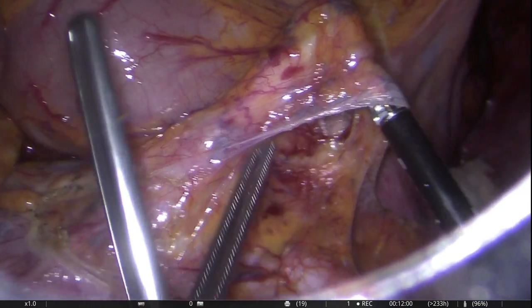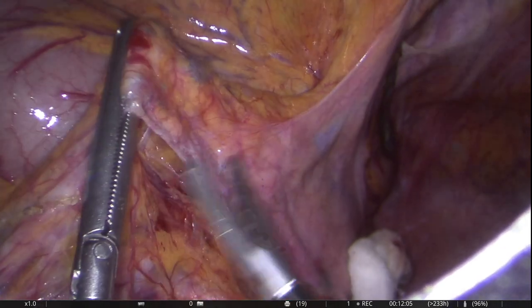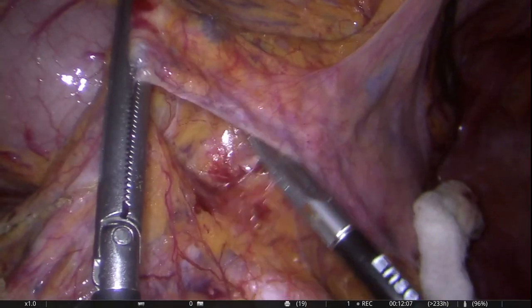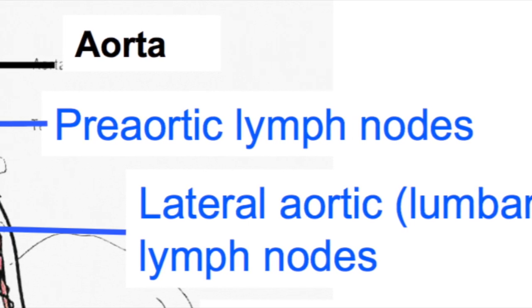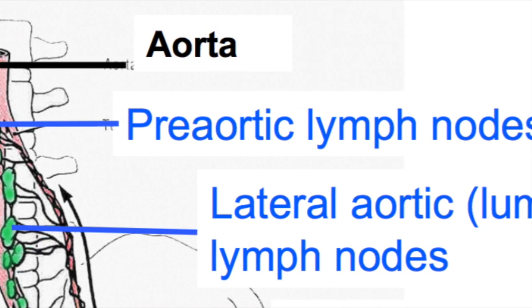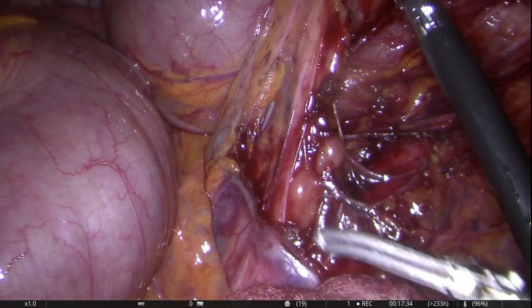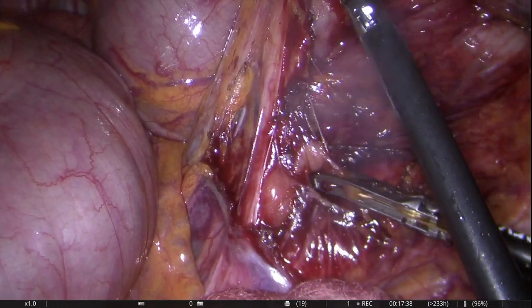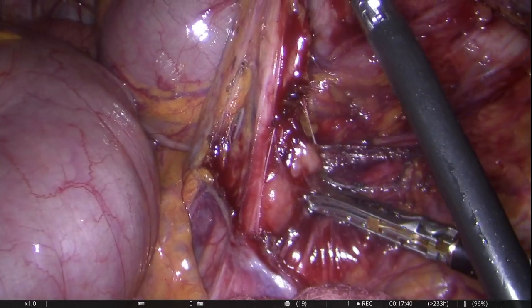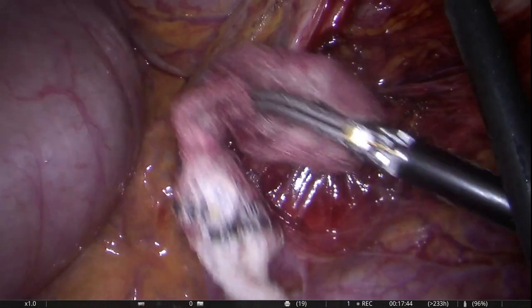In this particular patient, dissection is taken right up to the origin of the IMA onto the aorta. The pre-aortic lymph nodes lie in front of the aorta along the celiac, SMA and IMA vessels. As clearly shown here, the pre-aortic IMA lymph nodes are being dissected straight off the aorta.